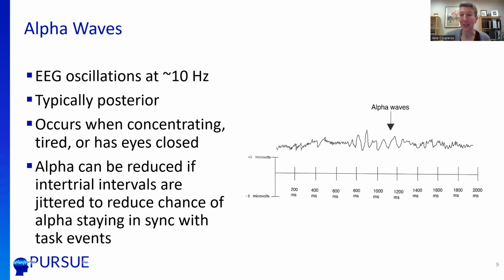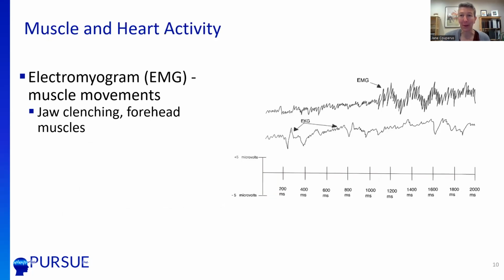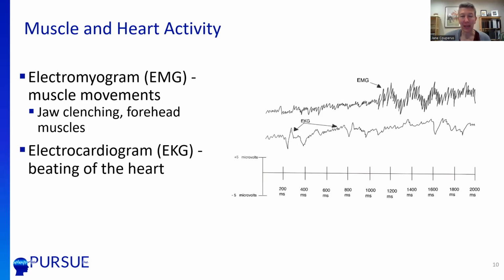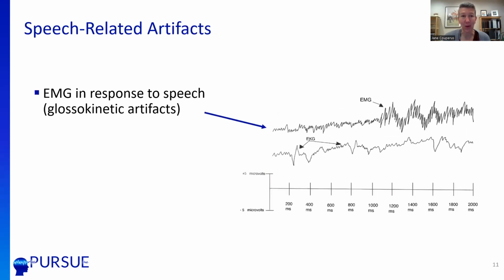Just your environment and how you're setting up your experiment is important. There's also muscle and heart activity. So if you're clenching your jaw or your forehead muscles or you're squinting, that's going to create muscle movement that is much higher in frequency. You can also pick up electrocardiogram, or the beating of the heart. Sometimes if an electrode is too close to a really big vessel, you might pick up electrocardiogram activity, and you don't want that as well.